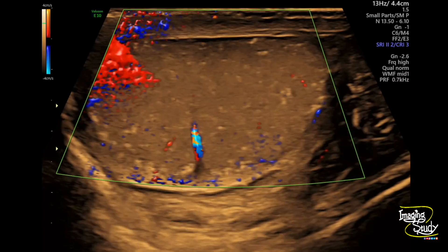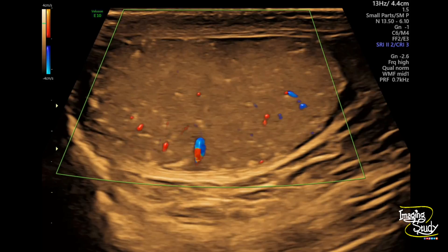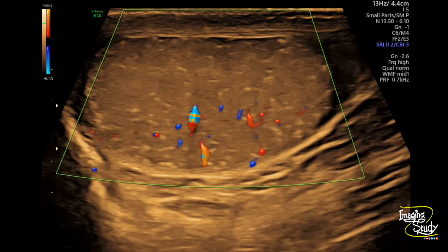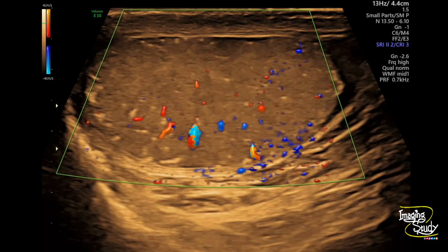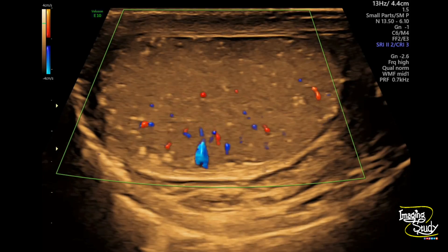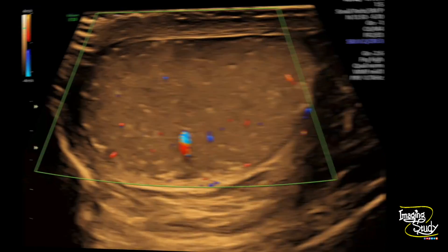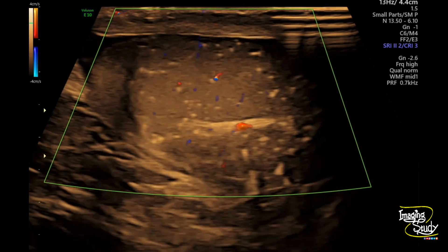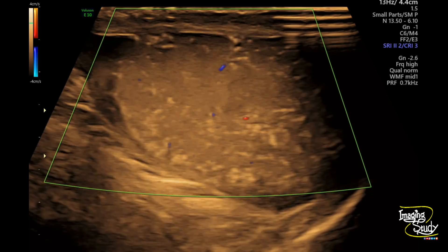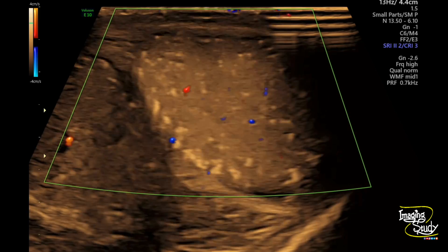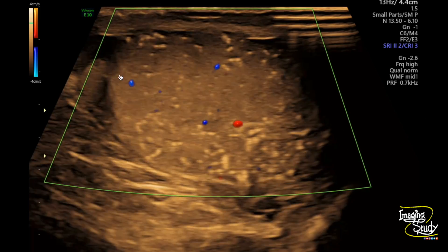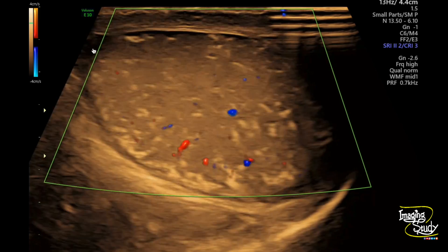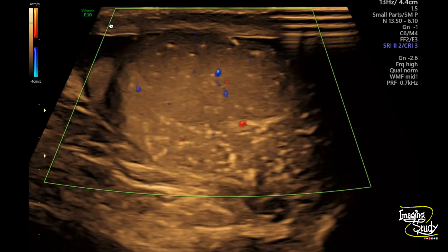Here we have applied color Doppler and you can see normal vascularity of the right testis. Looking at the left one, the vascularity is also normal here. There is also minimal collection in the left hemiscrotal sac.